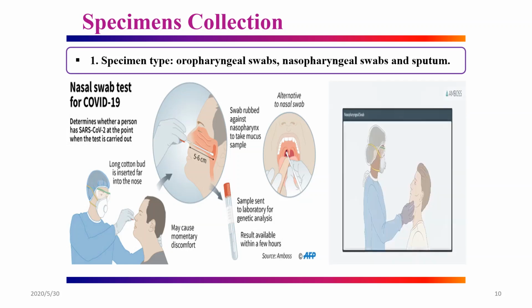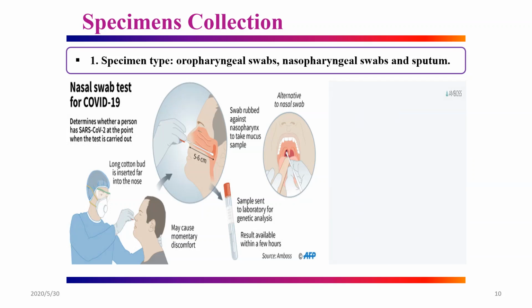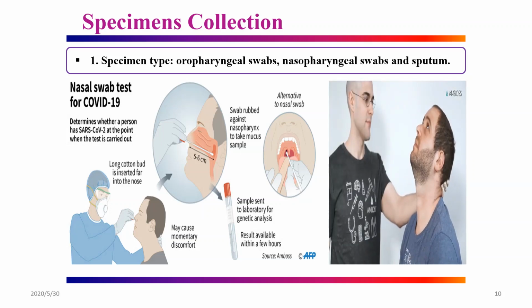Let's begin with the nasopharyngeal swab. The patient should be alert and cooperative. Allow them to first blow their nose. The patient should sit in a relaxed and comfortable position during the sample collection process. Tilt the patient's head back slightly and support it with your non-dominant hand. If necessary, lean the patient's head against a wall to minimize jerky movements. Stand slightly offset from the patient to avoid the risk of contamination in case of a sudden cough or sneeze.